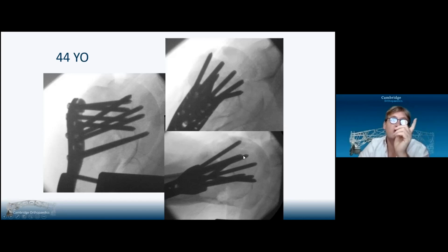There actually wasn't a lot of bone loss here. There wasn't a lot of humeral head loss. And so the reverse Hill-Sachs, I didn't have to fill. And in fact, once I'd got that reduced and one or two screws from the same plate into the head fragment, I then tested the patient.